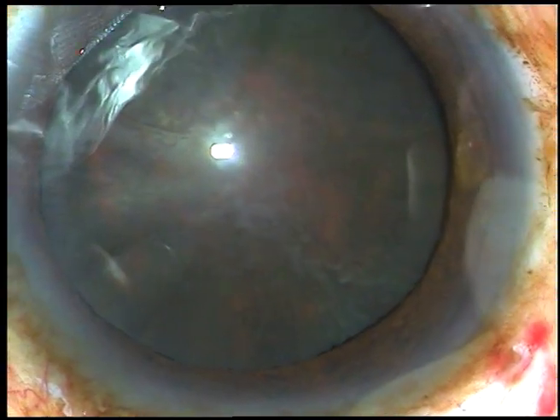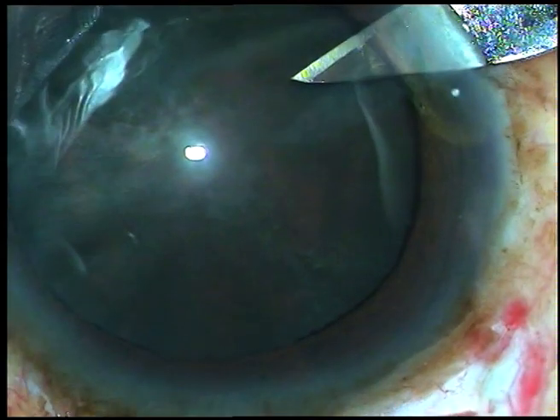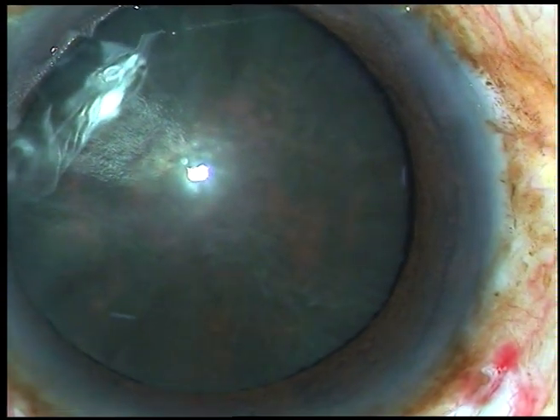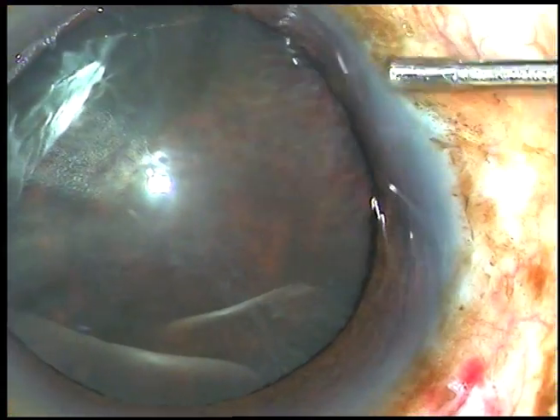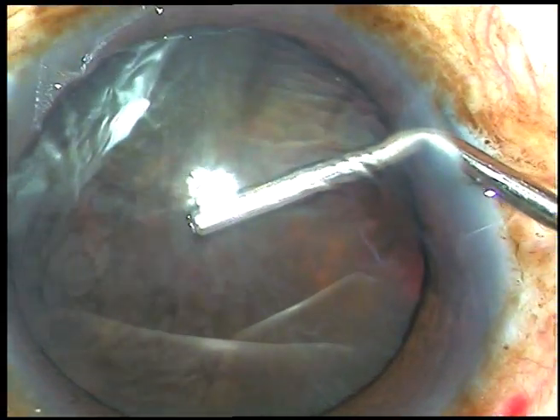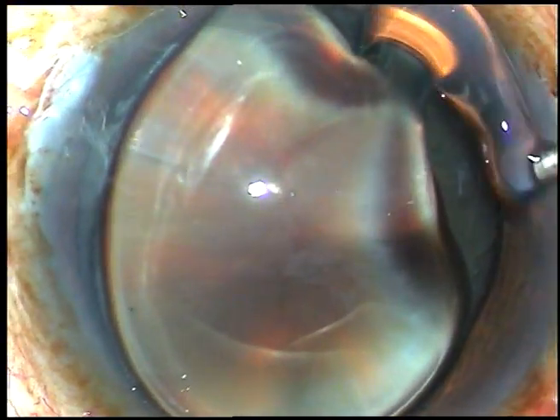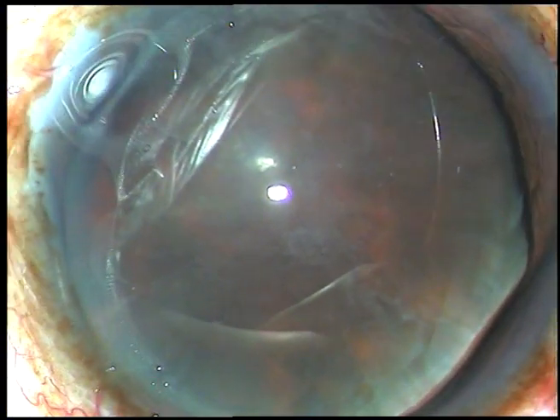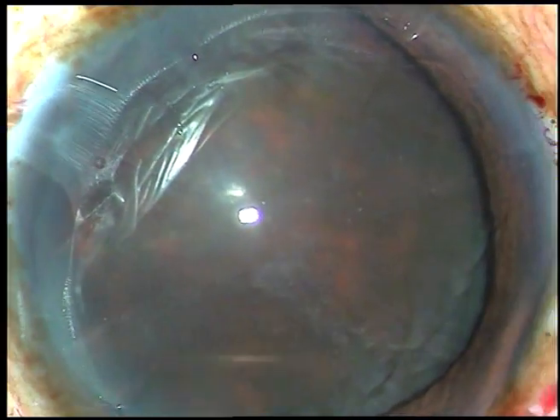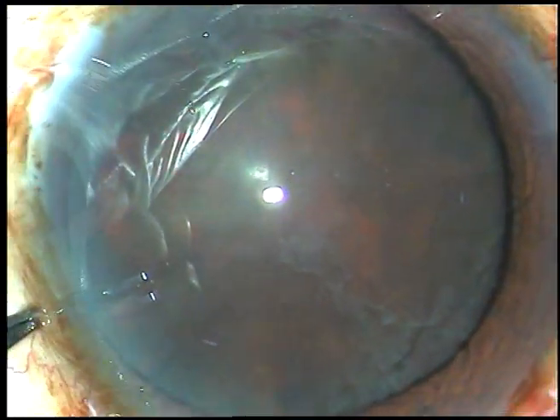Now this is a side port incision at around 8 o'clock. Inject viscoelastic substance through the side port. Apply the visco over the corneal epithelium for better visibility — yes, it improves visualisation.